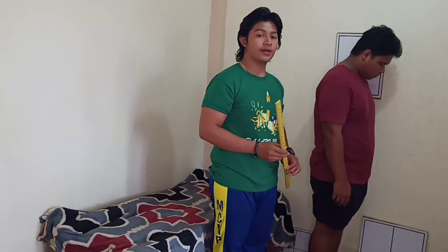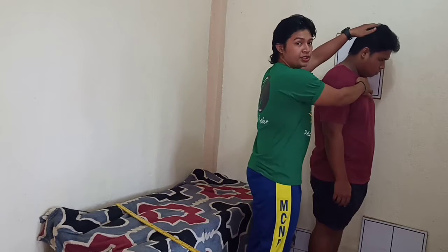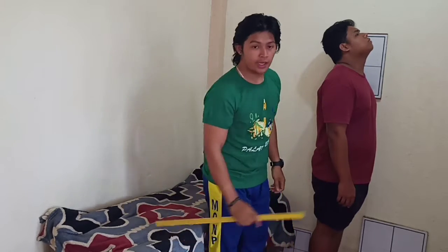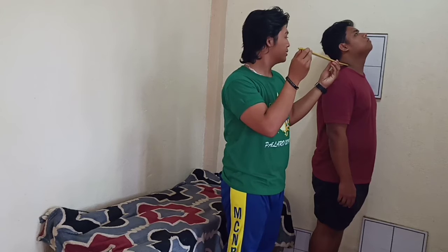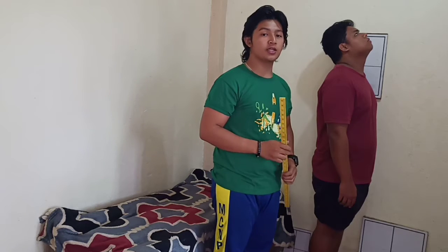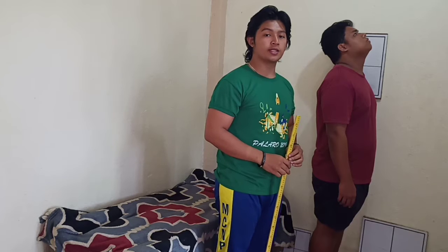And next is the hyperextension. Elevate the chin as much as possible. And the central ray must be perpendicularly directed at the level of the C4. The structure shown in this projection is the spinous processes depressed in close approximation and all the 7 cervical vertebrae in lateral.